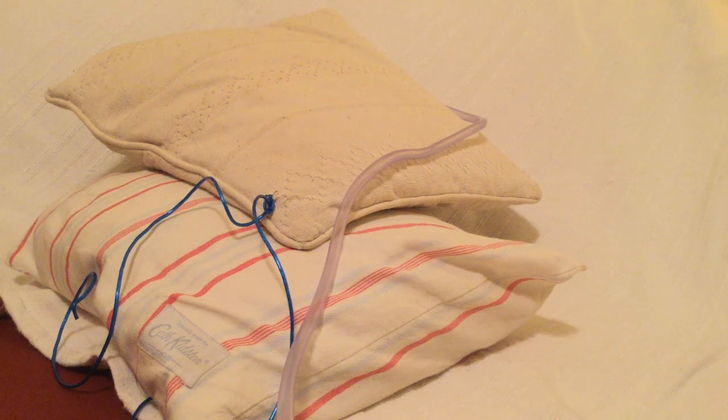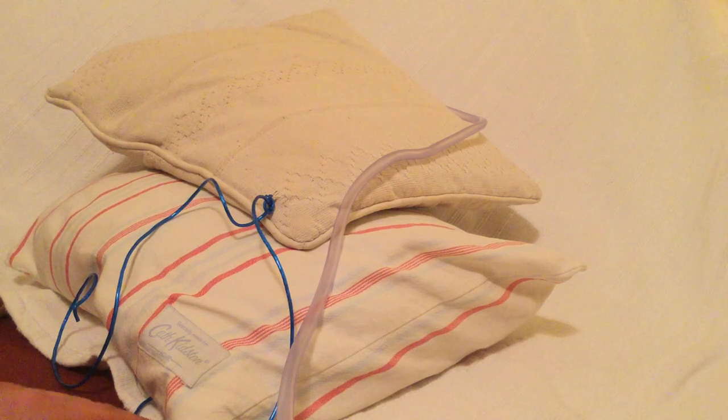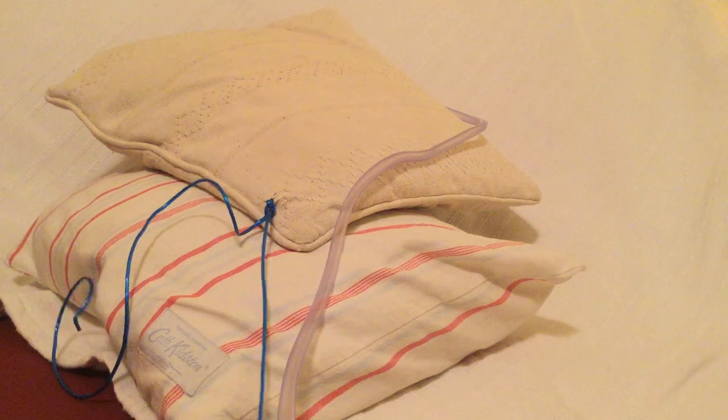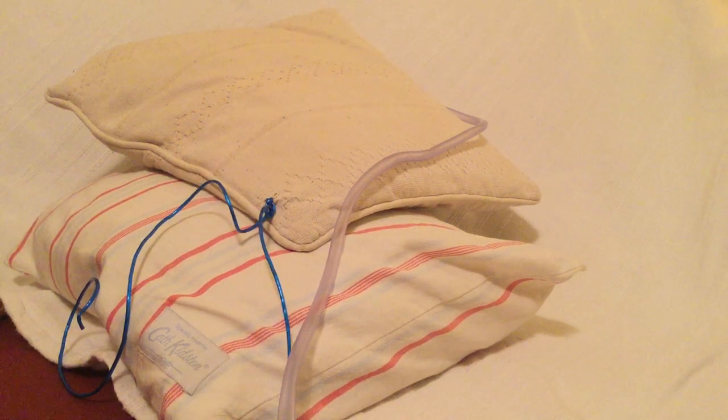Hello, welcome to this demonstration video on using the clove hitch knot to secure drains. We will be using a large drain and a large tie in order to simplify the demonstration of this technique.